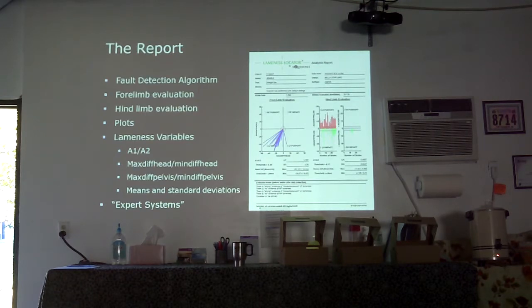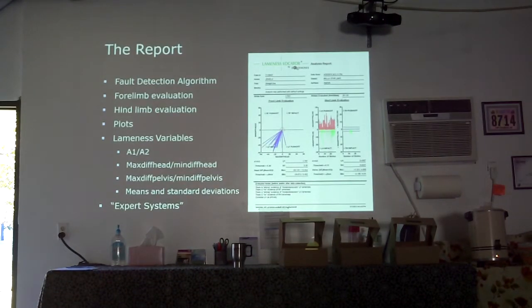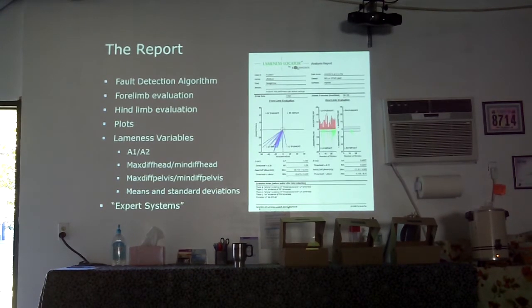It's actual height. Minimum height, maximum height. Okay. Now, what if the ground's not level? I mean, a stupid question, but you're measuring heights, and you've got accelerometers. So if the surface is not perfectly flat, like this floor, how does that affect the data?